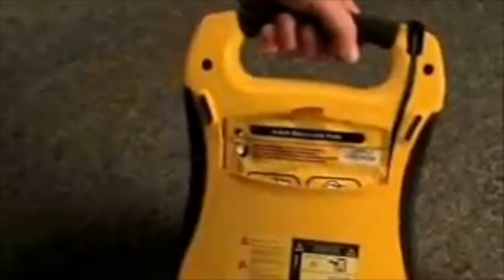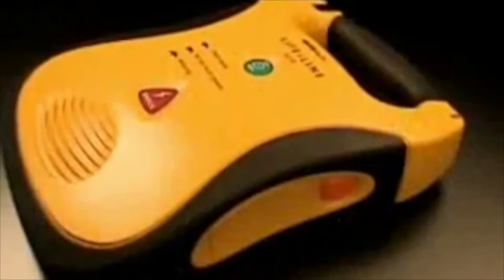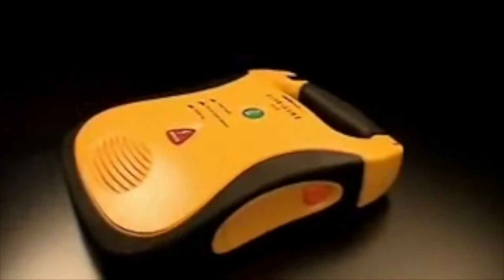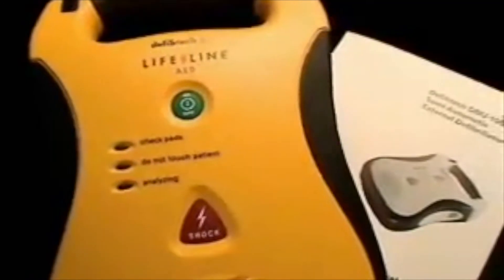Roomy handle, even for gloved hands. No lid to break or slow you down. A status indicator you can actually see. And the industry's only seven-year battery. The Lifeline is light and compact, yet so durable that it has been tested to military specifications.